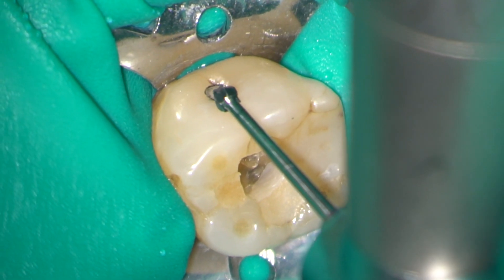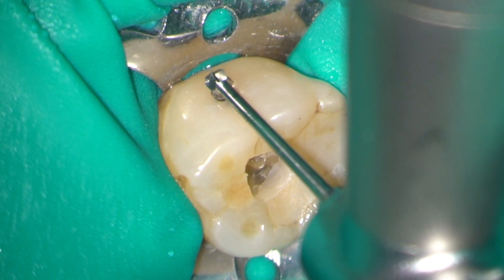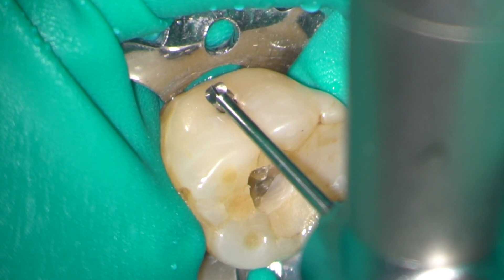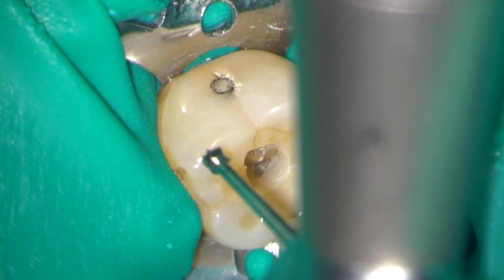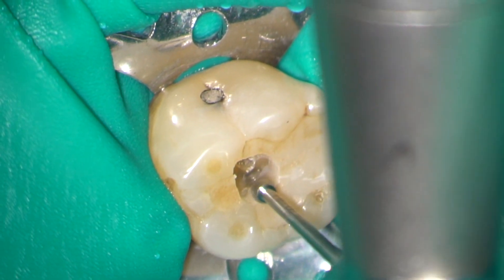I'm now using a large LN burr to perforate the pulp chamber, and I'm measuring it against that amalgam that I saw on the radiograph.